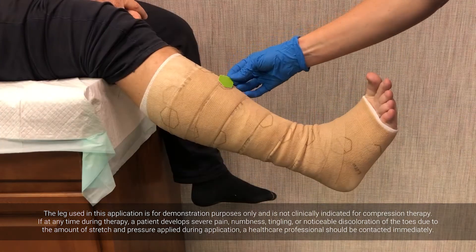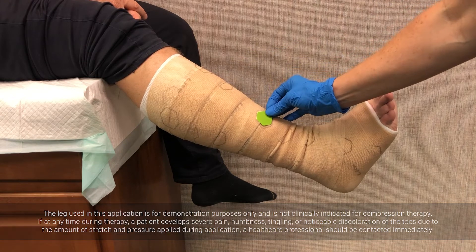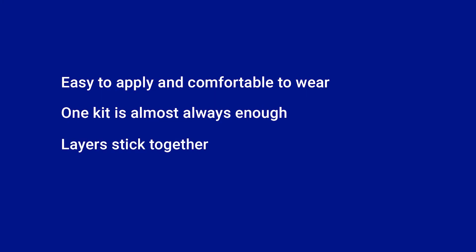The correct extension may also be checked with the green cardboard template, which is provided with each kit. Check that the indicator on the bandage fits comfortably around the template on all sides. In summary, 2Press 2 Lite is easy to apply and comfortable to wear. The generous length of the two bandages ensures that one kit is almost always enough. The two layers are designed to stick together and remain securely in place without slippage. There is no measuring, no sizing, no scissors.